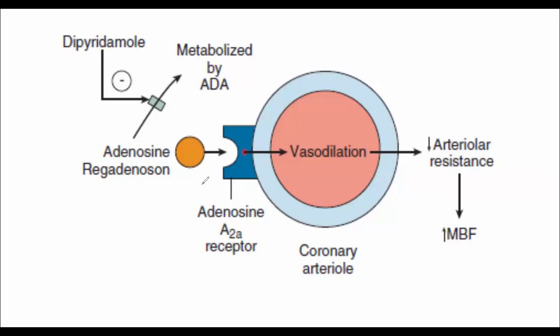So in vasodilator testing, we commonly make use of these three. We use dipyridamole under the name Persantine. So using the Persantine test, or dipyridamole test, as we inject it, it is going to vasodilate the coronaries. And as it vasodilates the coronaries, again the same thing comes.